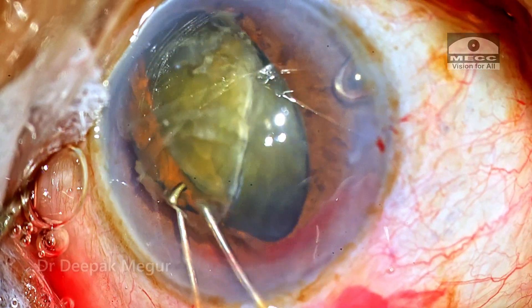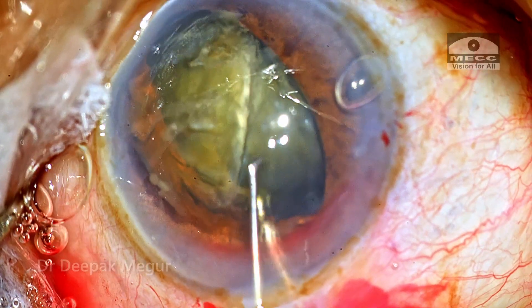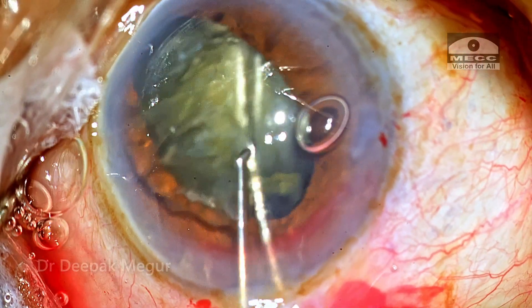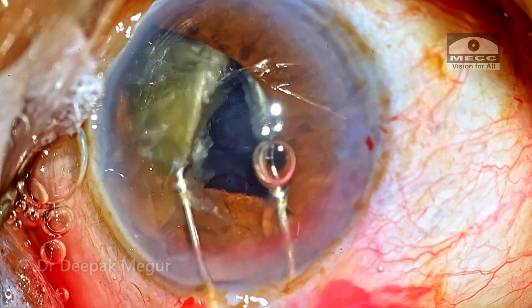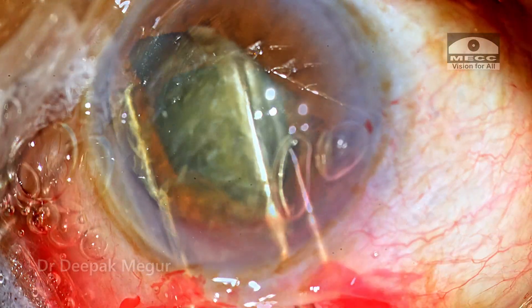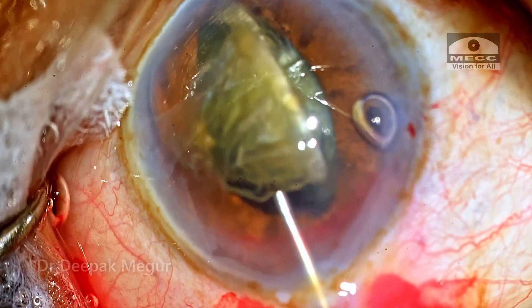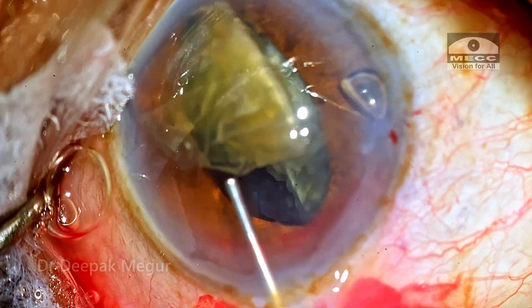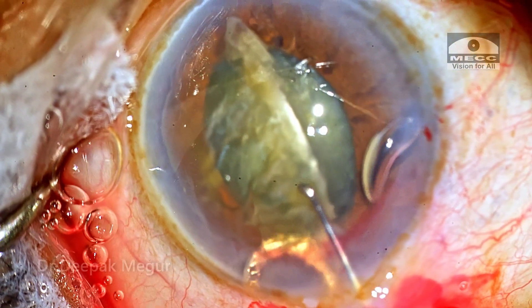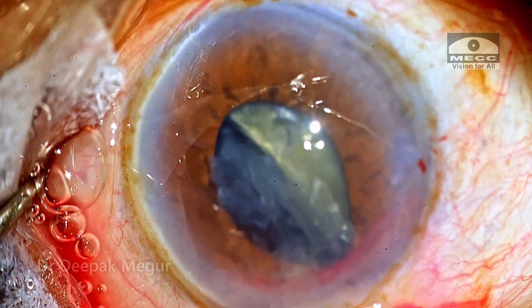The second hemi nucleus also tries to come along as the posterior plate is not completely separate. The Sinski hook itself is used to break the fine attachments separating them, and eventually only one hemi nucleus is prolapsed out of the bag.